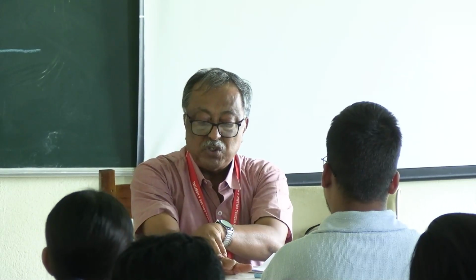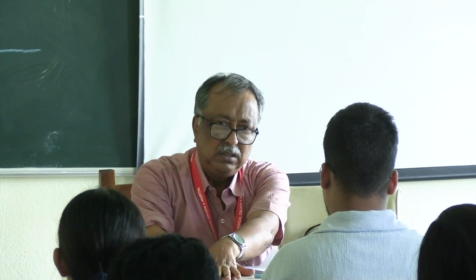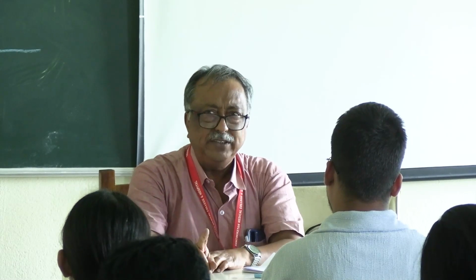Now the speech audiometry. Mostly the audiometries are the subjective part. Mostly the pure tone audiometry is subjective. You ask the patient to raise your hand when you listen, and he will listen. If she is not eager to listen, or has some psychological problem, she will not show you the hand. It's very subjective.